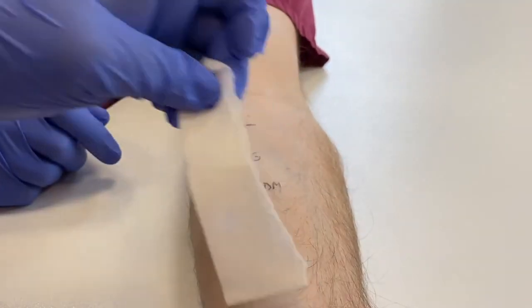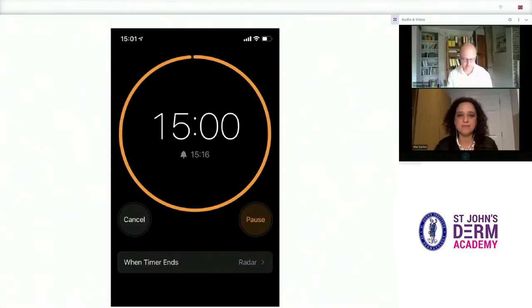If any drop is missed, it can be easily sorted with an extra dab with a new tissue. Now we set a timer for 15 minutes, which is when the results should be read.